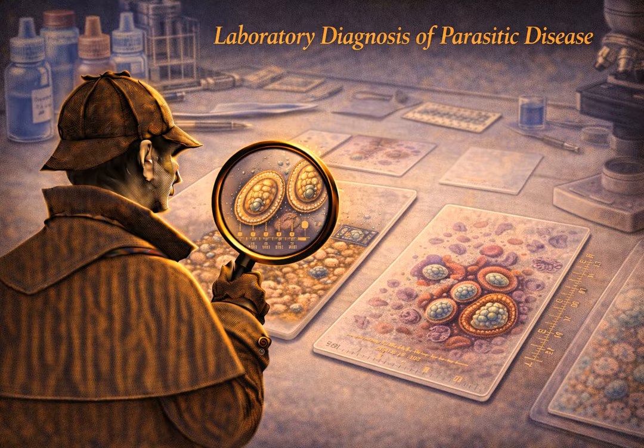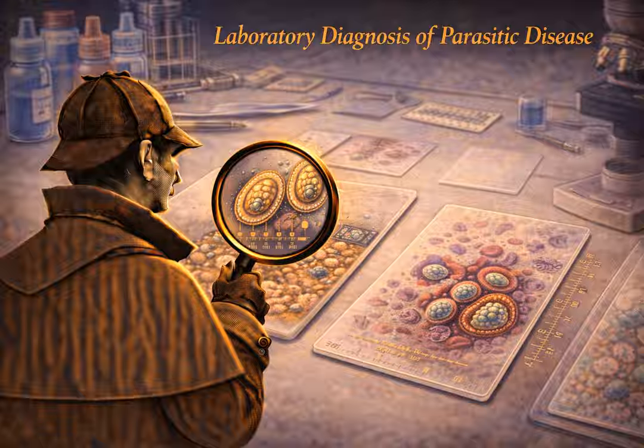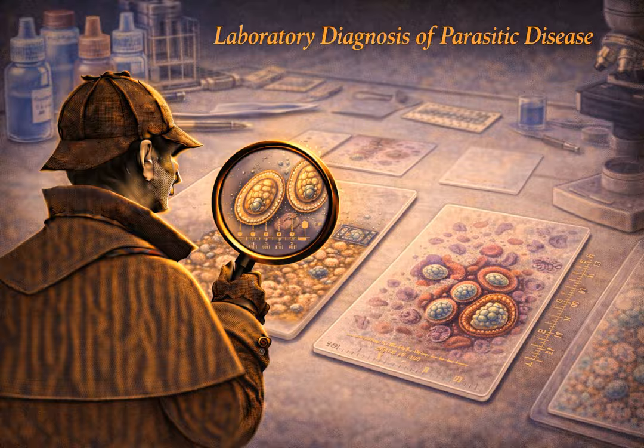So the rigid protocol is to collect 3 specimens over a period of usually 7 to 10 days. And crucially, they must be collected on alternate days. Why alternate days, though? Why can't the patient just fill 3 different cups on a Monday morning and get it over with? Because of that intermittent shedding cycle, if you collect 3 samples from the exact same bowel movement, or even just from the same morning, you are essentially sampling the exact same batch of stool. You aren't increasing your temporal spread at all. You want to sample on Monday, then Wednesday, then Friday. You need to cast a wide enough net over time to catch a shedding cycle.